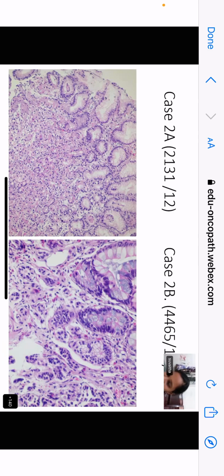Anything else? Shweta? Amy? Anything else? Dia? Ma'am, I can see one nest. Ma'am, I can annotate that. Yes, please annotate. Yes, you can see a nest. Is there just one nest? There are many nests beside it, and ma'am, they are having. Yes. What are they having?